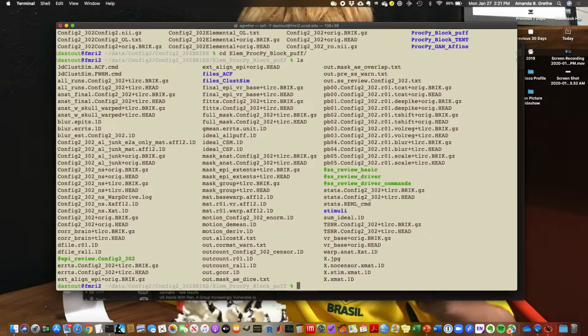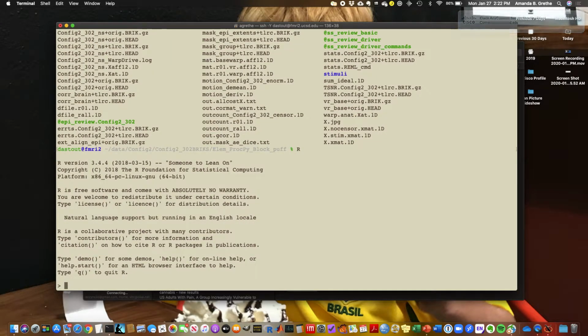If you're familiar with afni_proc.py, it creates a subdirectory within your subject folder that holds all of your pre-processing files. What I'm going to do now is look at one of the output time series after pre-processing, to compare whether I increased the signal to noise, and whether I can eliminate some of the other sources of noise.